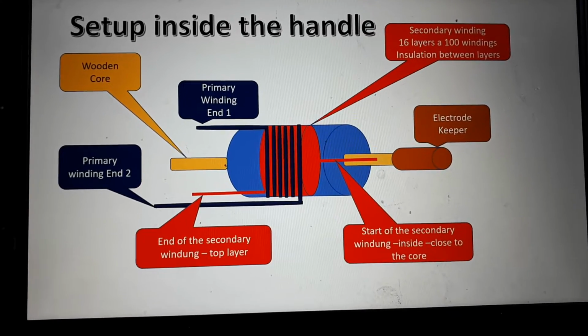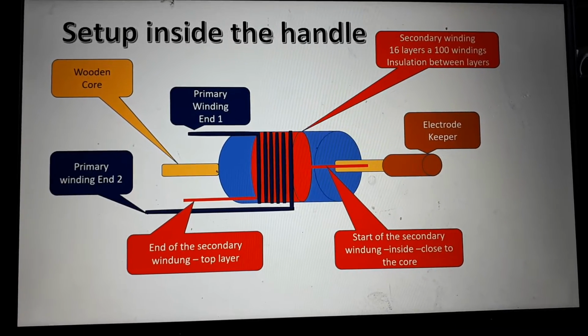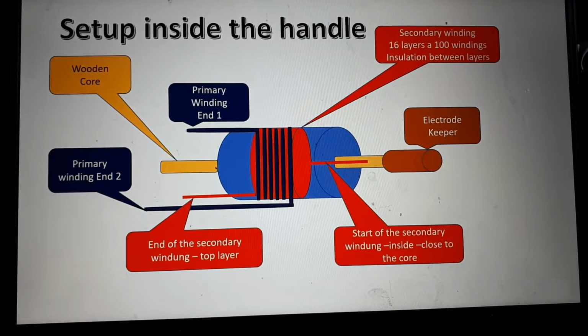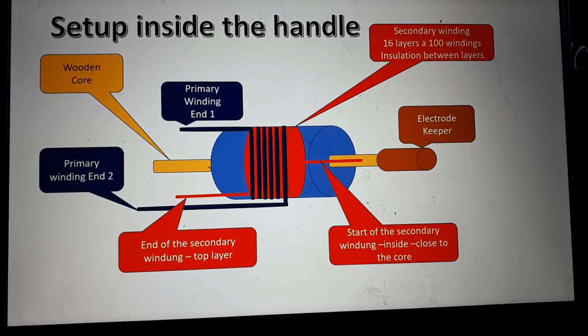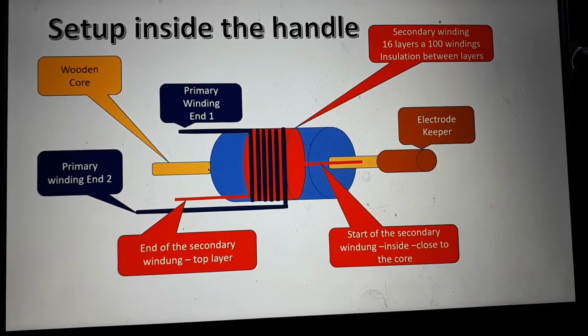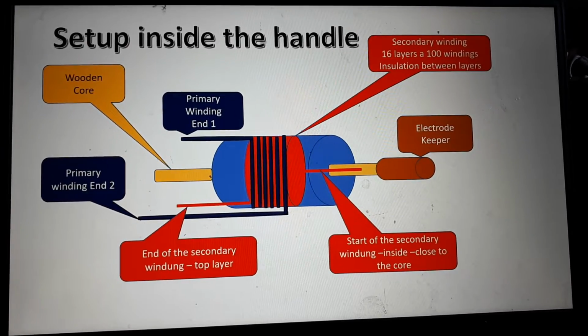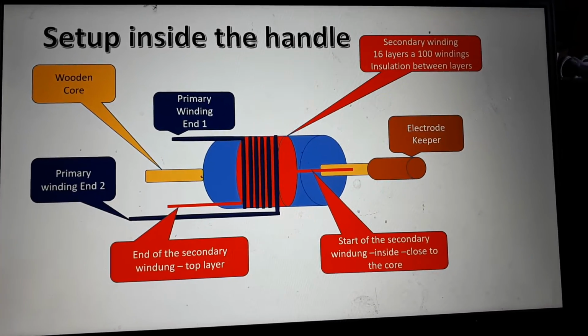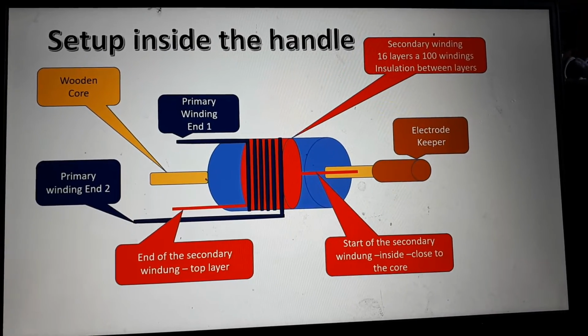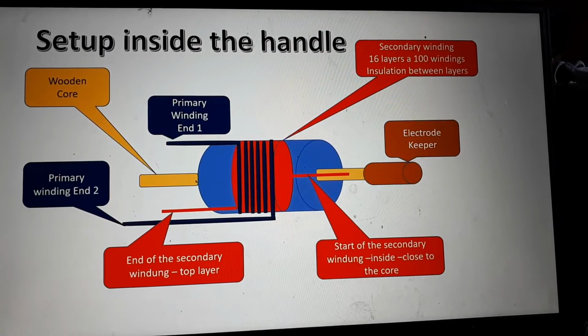Hello. Today it's about the Tesla coil inside the handle of our violet ray devices. We have two kinds of windings here. The primary winding, which is at the surface and which you can see directly if you look at the coil. And we have the secondary winding, which is hidden by, let's say, isolation paper or something like this.